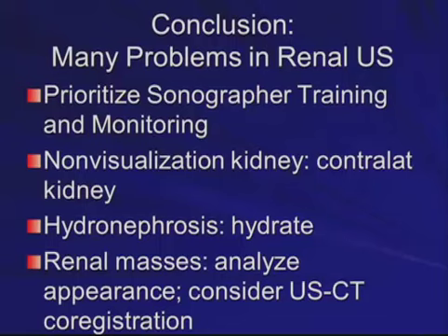So in conclusion, there are many problems that we face in renal sonography. However, if we prioritize sonographer training and monitoring, if we realize methods that we can use to address problems such as non-visualization of the kidney or hydronephrosis, and then finally, if we're very careful about looking at our images so that we don't miss renal masses, then we can at least optimize the way that we look at the kidneys and reduce the number of lesions that we miss in those organs.